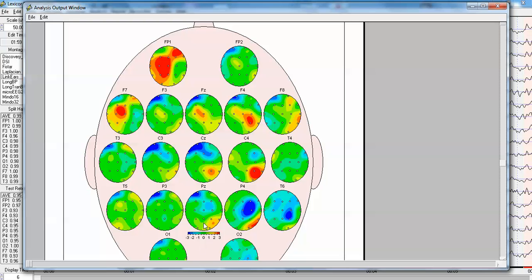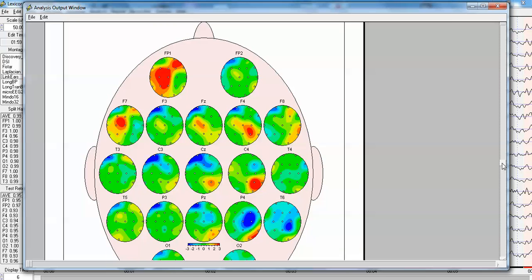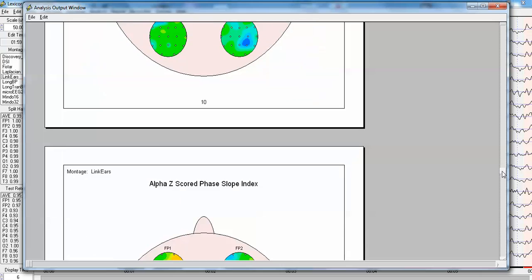So information is flowing in this direction, and this is not normal. This is outside of the normal range. This is three standard deviations deviation in the direction and magnitude of information flow, which is complementary to the coherence. So this is a demonstration of phase slope index, or effective connectivity.